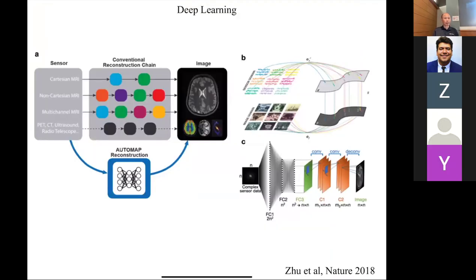So now we switch to deep learning, which I'm sure everyone has heard of. And actually, when we first started talking about deep learning, there was no chat GPT. So MRI was already starting to do this even before the public really got excited about deep learning. And it wasn't until about 2 years ago that chat GPT really took off. So this predates all the LLMs, but some of the ideas are very similar. So the idea is that here's my data, right?